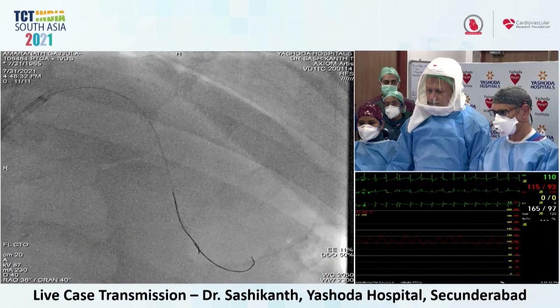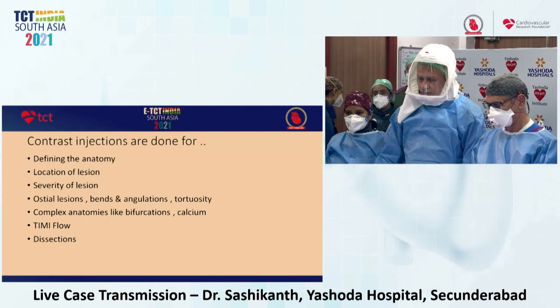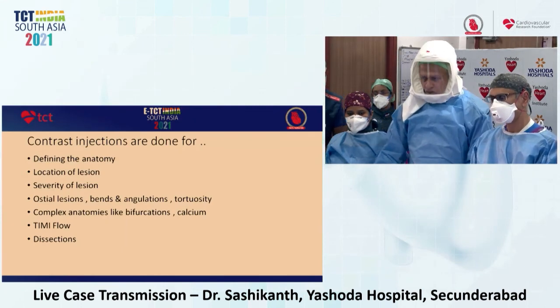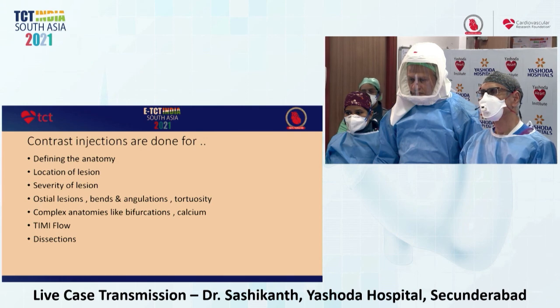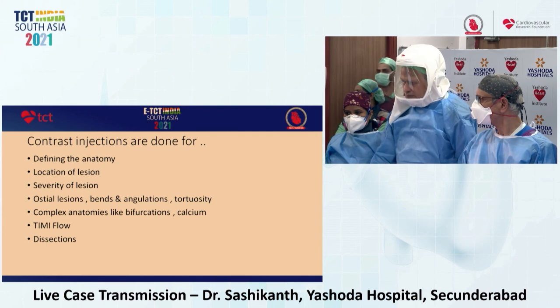Yes. And that's it. I think this is a suitable option if patients refuse to go for CABG. True. And what I have done in my practice, we sometimes go with a similar approach, and we use gadolinium for the final shot. This is also a working procedure.